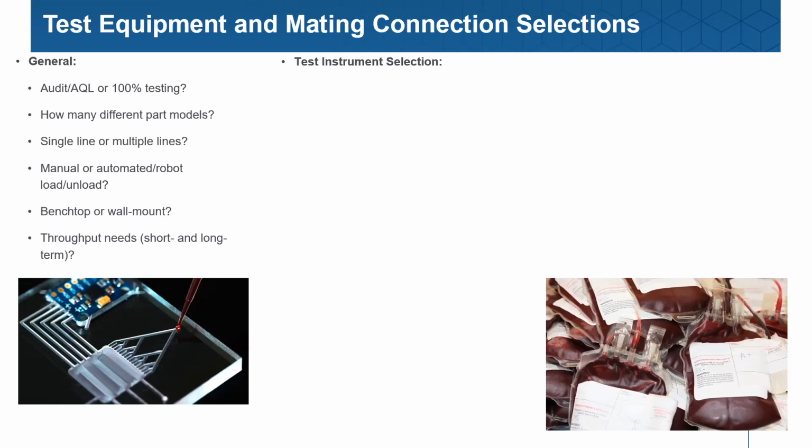Well, that makes your equipment selection a lot different than if you are having a piece of automated equipment built that's designed and capable of running 6 times the initial volume. But initially, it's just going to be set up to run fewer hours. Things like that are what you'll bear in mind in terms of cycle time and how many parts we must test each testing cycle.